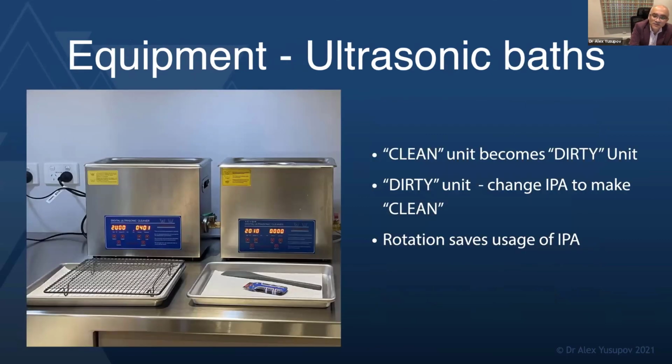Ultrasonic baths: clean unit becomes dirty unit. A dirty unit, change the IPA to make it clean. So it means that each bath gets used twice, which means we're saving the IPA and still getting reasonably clean models.